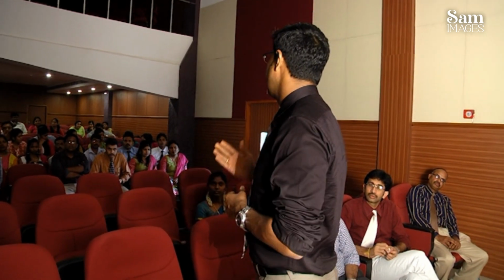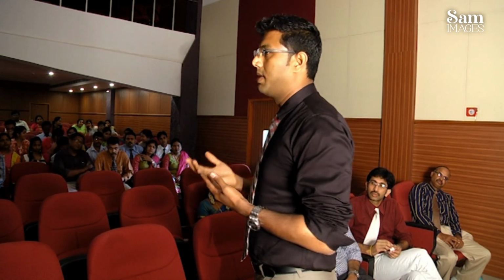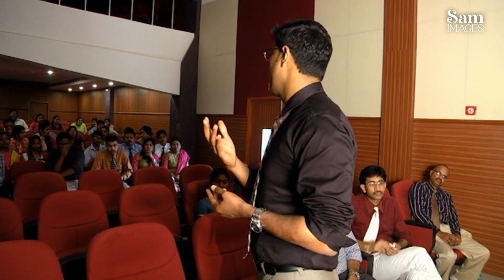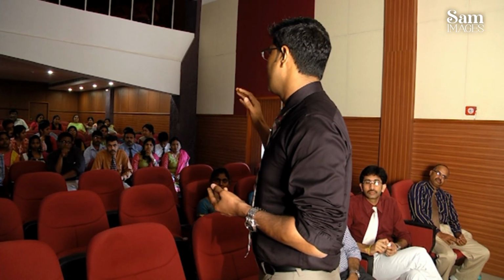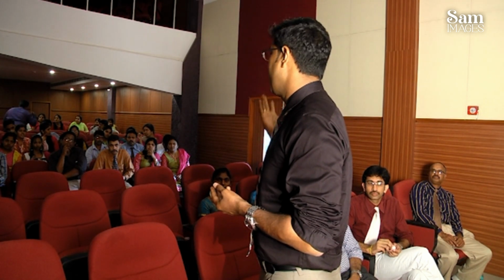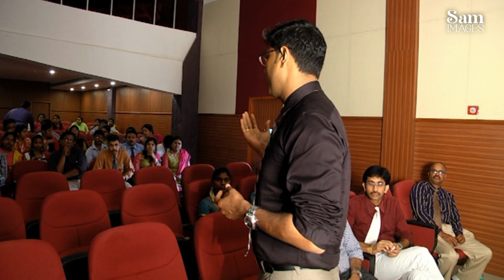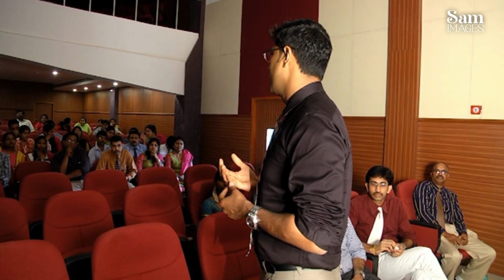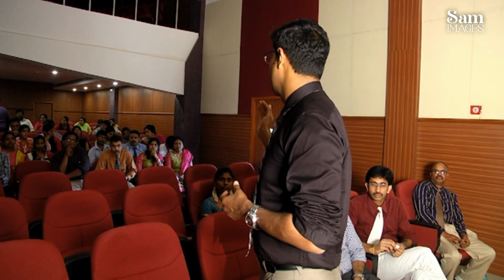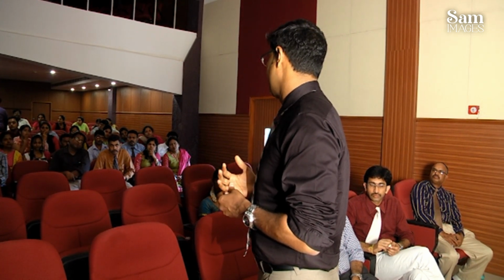Doppler is also very good for seeing the vascularity of flaps, not just collections underneath the flaps, but the vascularity as such. Sometimes we have flap rejections. Similar to what I told you, the very low resistance bed of the flap slowly becomes a high resistance bed. Eventually you won't find any vascularity at all. That happens in flap rejection and avascular necrosis of the flap, which happens in head and neck malignancies after reconstructive procedures where we keep a flap. The pedicle flap, I think the flap will go in for rejection.